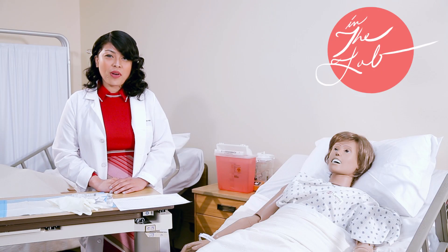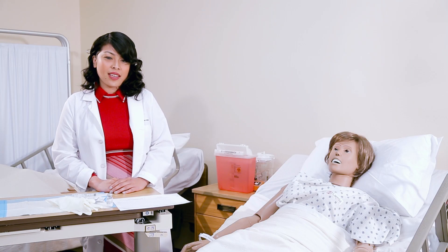Good morning, my name is Ms. Christine and welcome to the Angeles Institute Skills Lab. Today I'm going to go ahead and show you the proper procedure of drawing up medications from a vial.